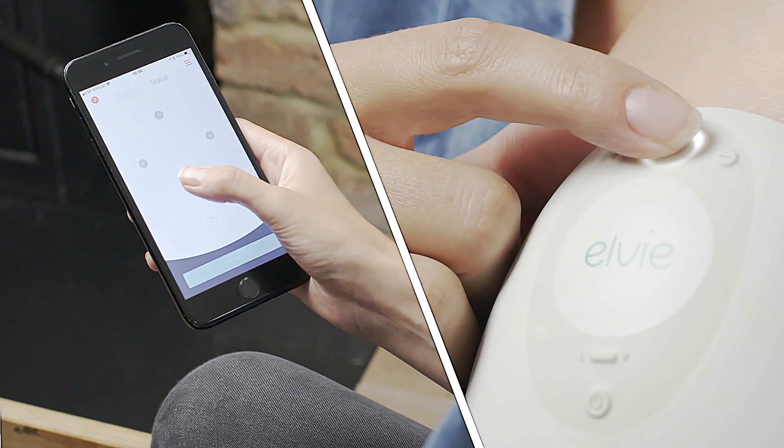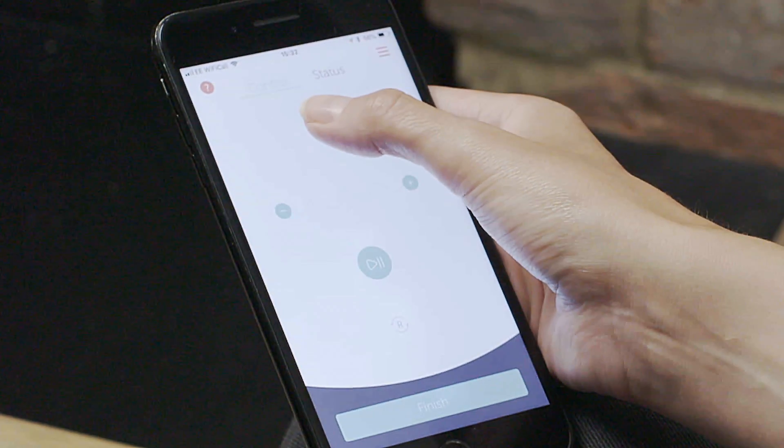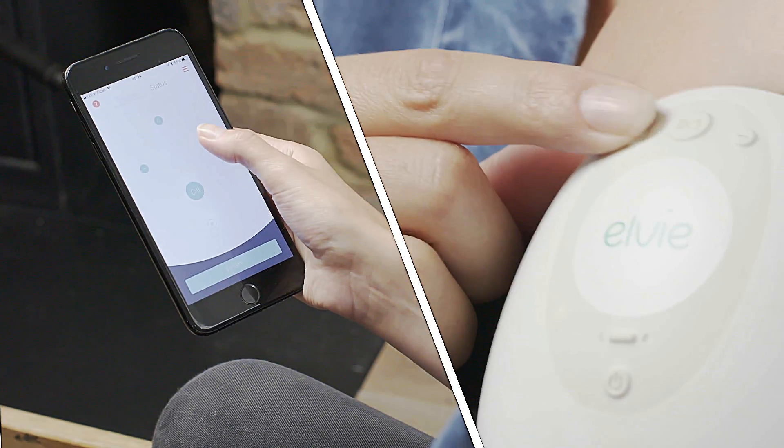Press play to start. The app lets you easily switch between stimulation and expression mode, and for each mode you can adjust the intensity to find the setting that suits you best.